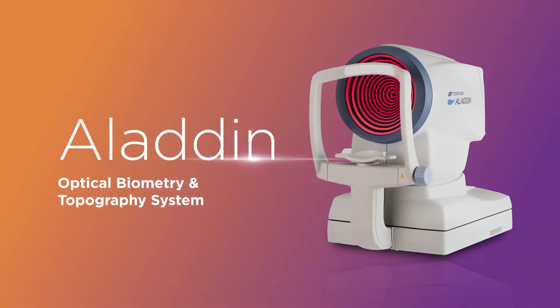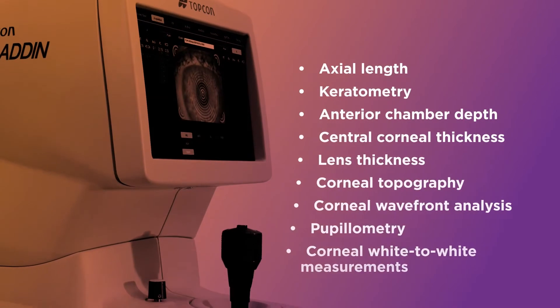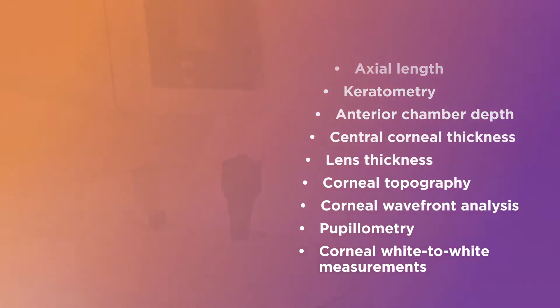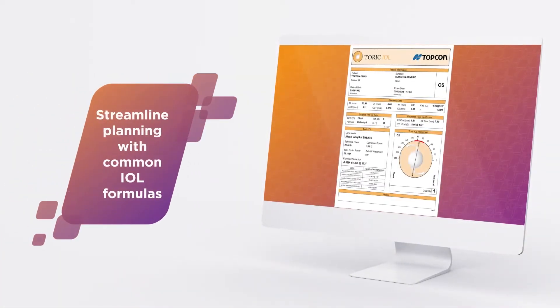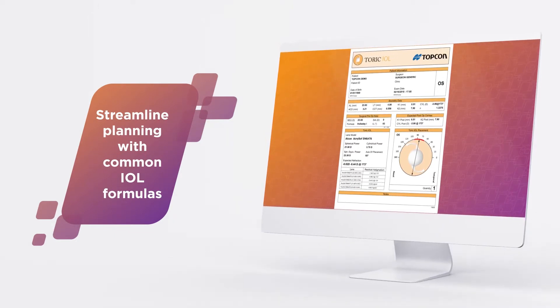The Aladdin Optical Biometer and Corneal Topographer captures nine key measurements to calculate IOL power and determine effective lens position, all with a single acquisition. It's equipped with the most common IOL formulas, including a Barrett and Olsen subsuite, to streamline surgical planning.